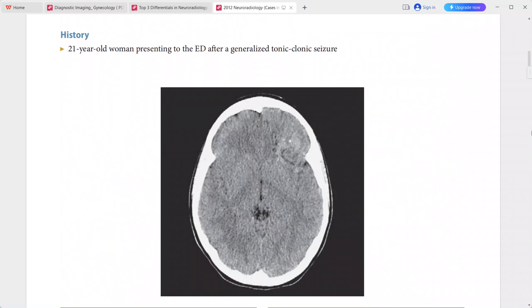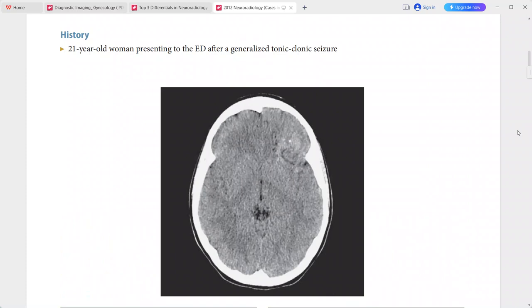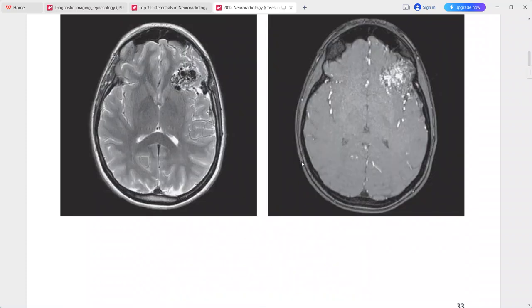Next case: 21-year-old woman presenting after a generalized tonic-clonic seizure. On CT, there is a heterogeneous mass in the left inferior frontal lobe, slightly higher attenuation than gray matter with a tiny focal calcification. T2-weighted sequence shows numerous curvilinear flow voids of varying sizes with no edema and very little mass effect.